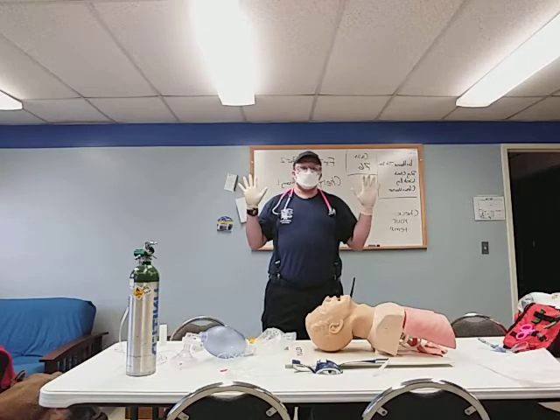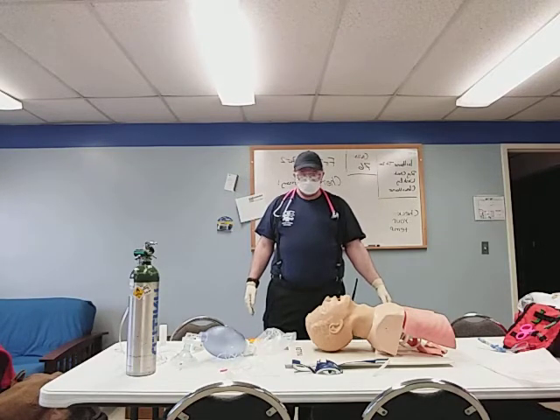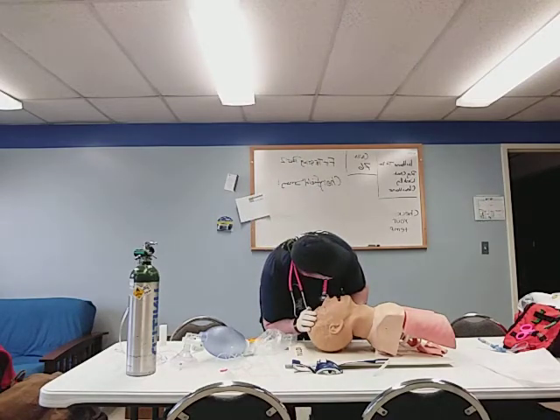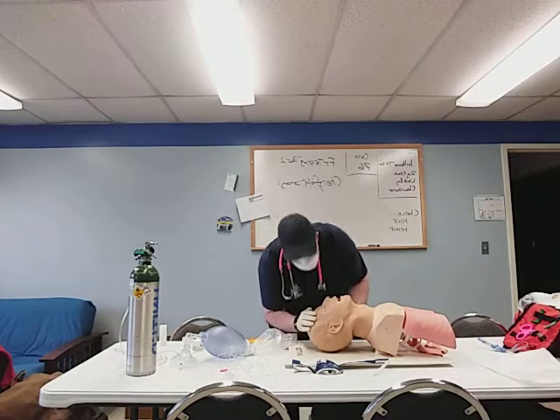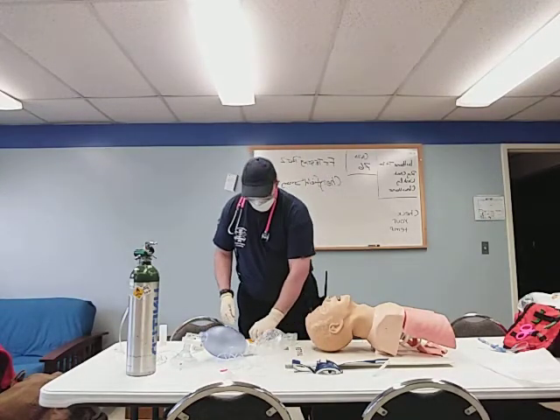I'm going to say, to start out, PPE for BSI. Is my scene safe? I am protected, and we will begin. Oh, sir, I don't hear anything. He's unresponsive. There's a palpated carotid pulse, but there's no chest rise and no sound of air movement. This person is very apneic.